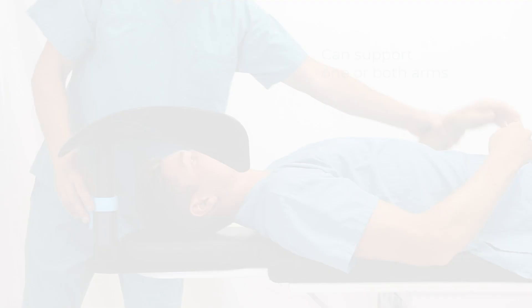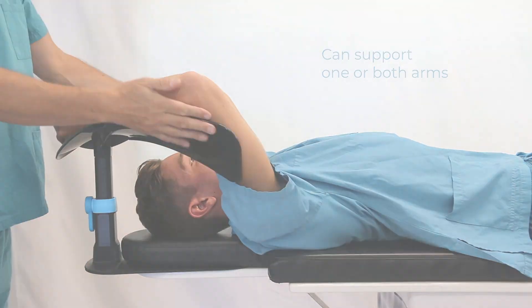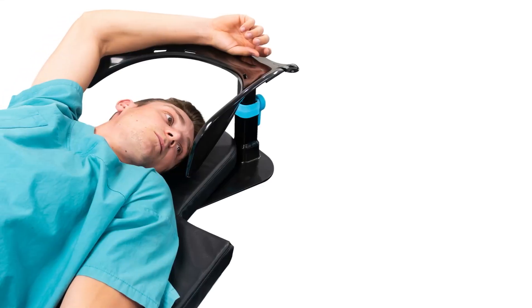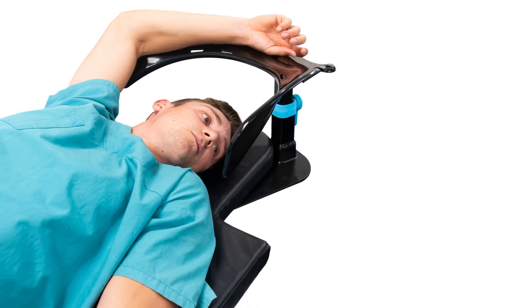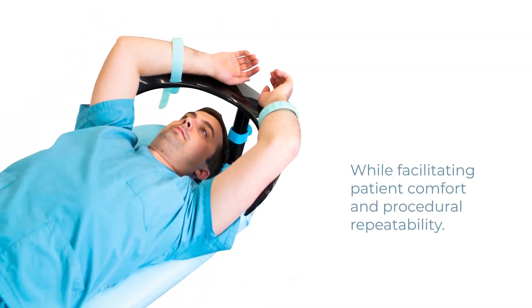The unique wing design can support one or both arms and will accommodate a wide range of patient sizes. The overhead arm support provides ease of use for the operator while facilitating patient comfort and procedural repeatability.